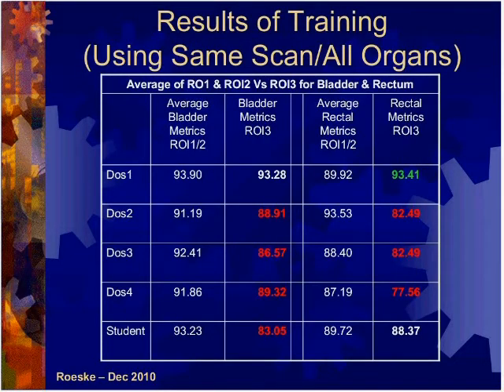In our first study, we simply had the dosimetrist repeat the contouring on the exact same scan. And interestingly enough, their scores got worse. This is counterintuitive, since one would expect them to get better, but in this particular case, it got worse. There's a couple of reasons for that. First of all, for this particular structure, this is just looking at bladder and rectum. The first time around, they all did very well.